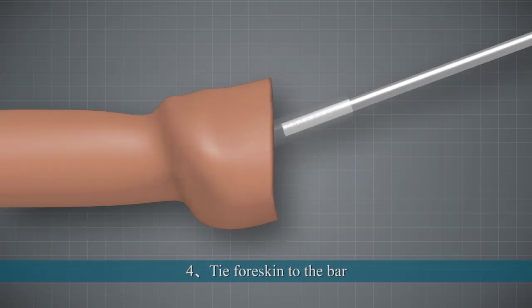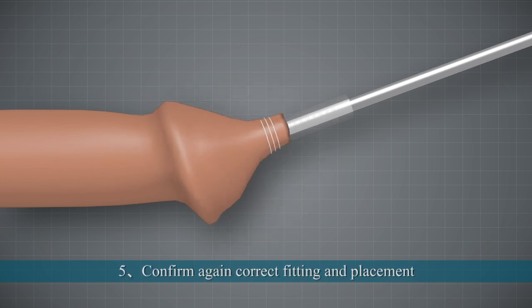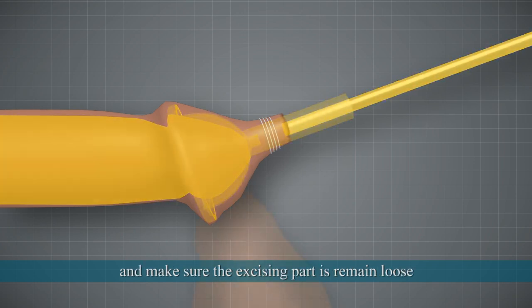Ensuring the correct excising position. 4. Tie the foreskin to the bar. 5. Confirm again the correct fitting and placement, ensuring the foreskin is tied to the clamp tightly, and make sure the excised part remains loose.